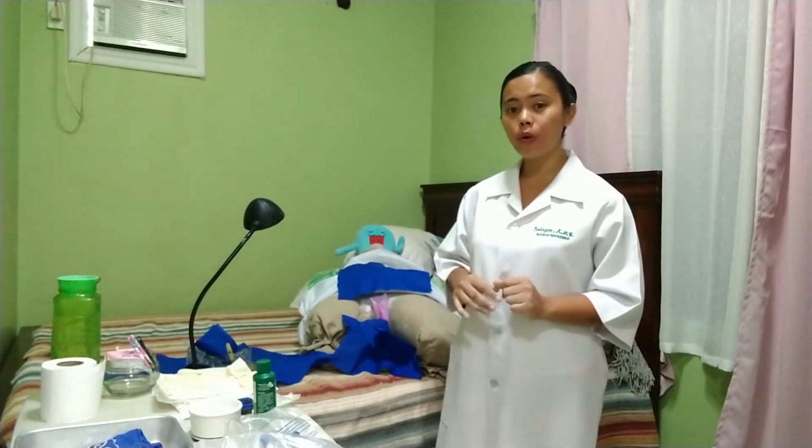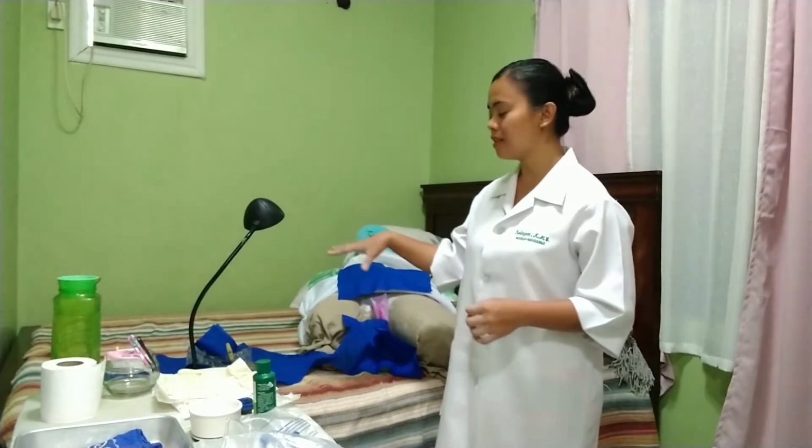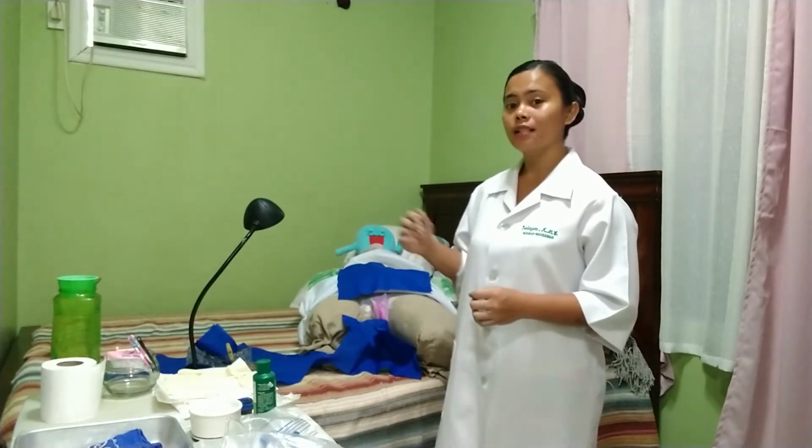Then, next step is to don gloves. Donning gloves is important to protect our patient from being contaminated or from unnecessary infection, and also that way we could touch things that are inside our sterile field.